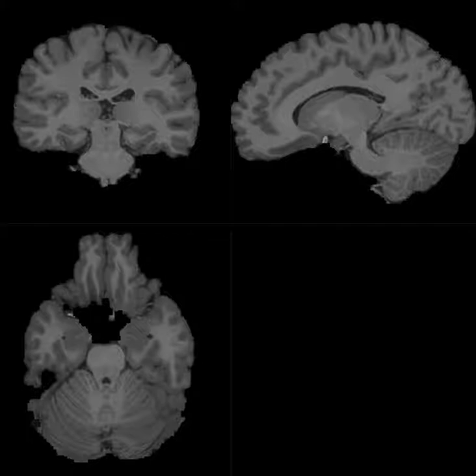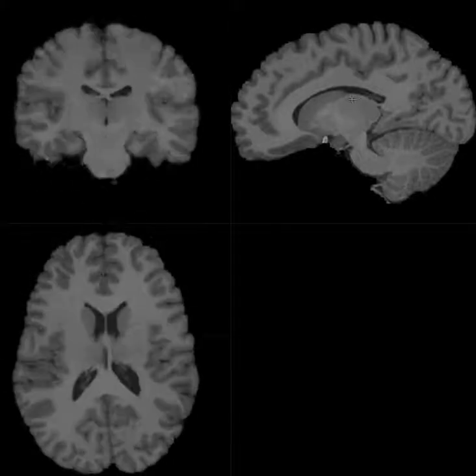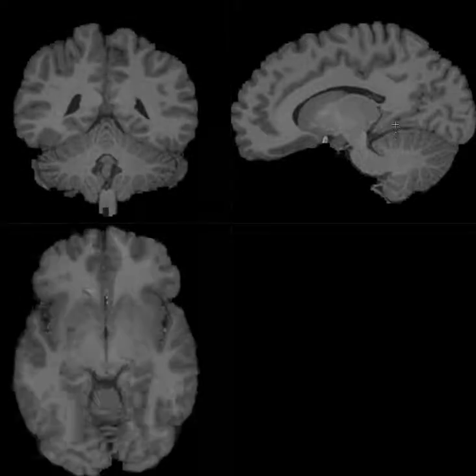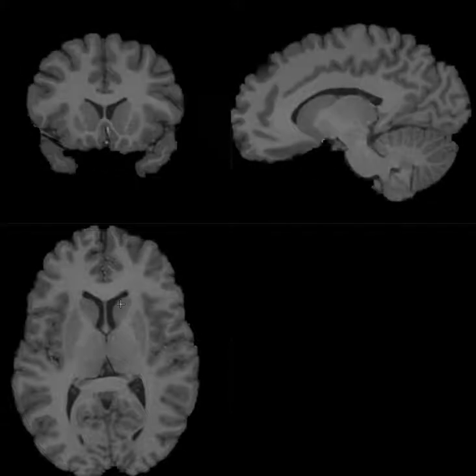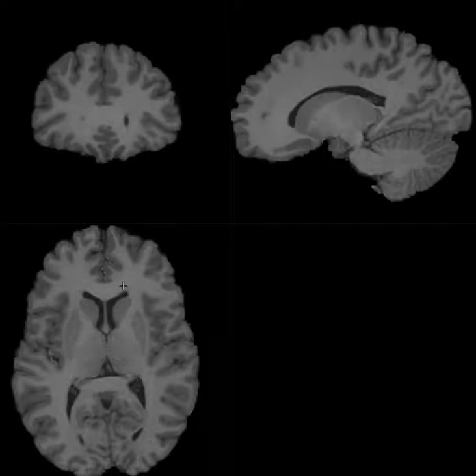So we'll start right here with our T1 weighted image. Now, T1 weighted image is what most people think about when they think about MRI scans. It's our anatomical image. And over here we have some data from the Human Connectome project. And we can scroll through this image and we can see that this is a nice MRI image of the human brain, right? And in this case, the gray matter, the cortical gray matter on the surface looks dark gray. The deep gray matter also looks dark gray, and the white matter looks lighter gray. So it's sort of what you'd expect.